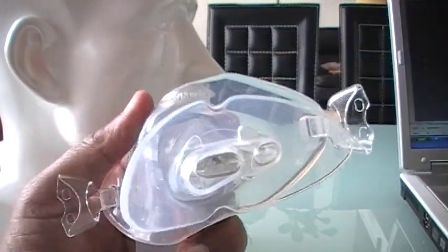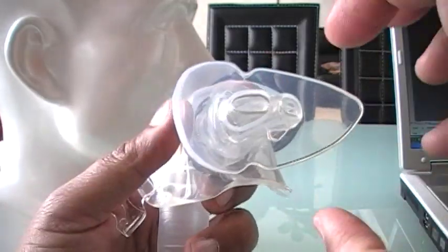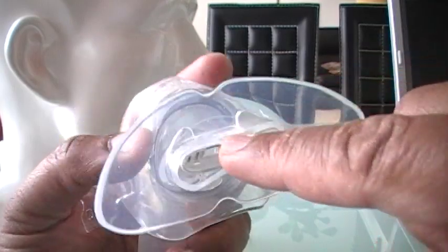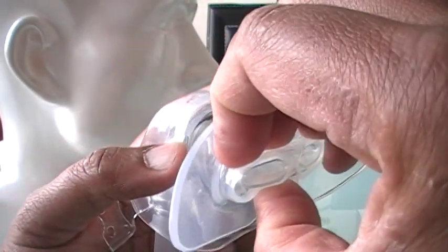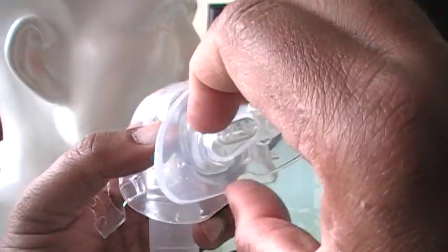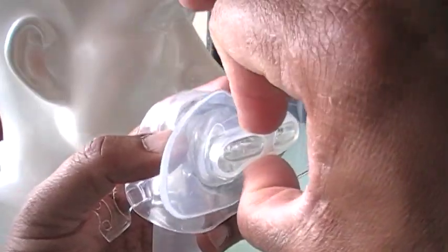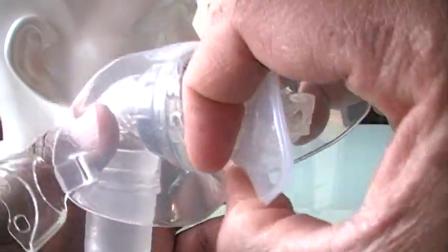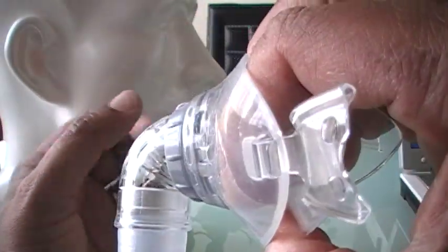What happens here is this: your teeth go over here. The air is going to come out of these two openings. Your teeth come up to here, your lip goes over here, and this flange then just holds it in place.